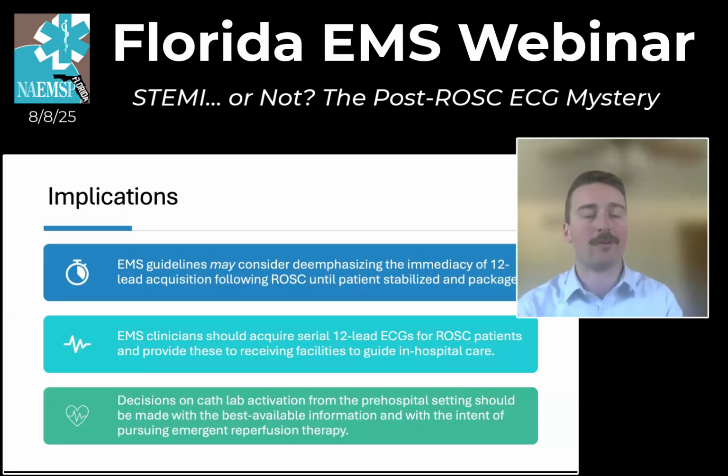There is certainly a lot of value to having systems in place to allow for the hospital to view these things. If systems are able to digitally transmit their 12 leads to the hospital and have those readily viewable in the emergency department, or at least provide the paper copies of all these EKGs.